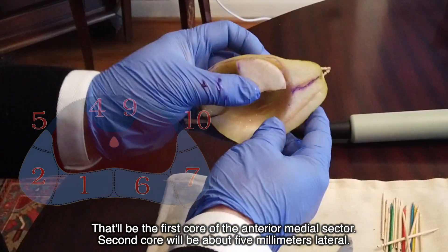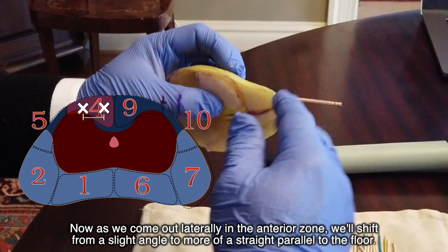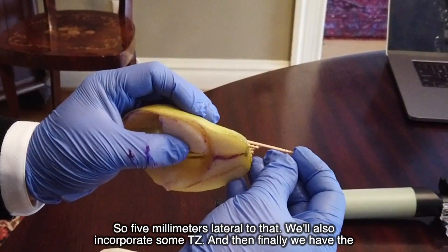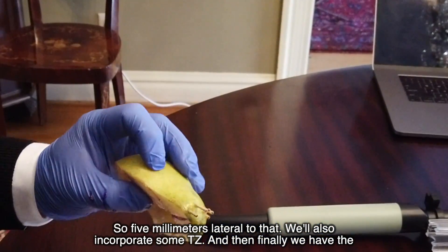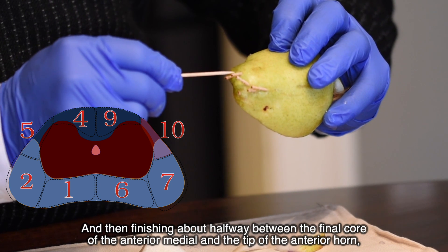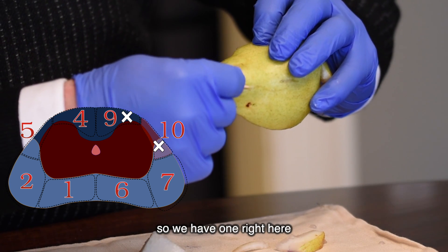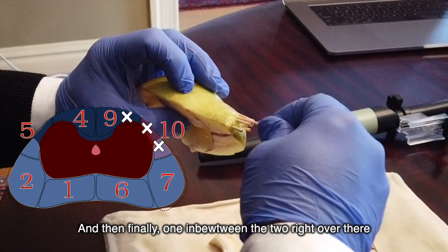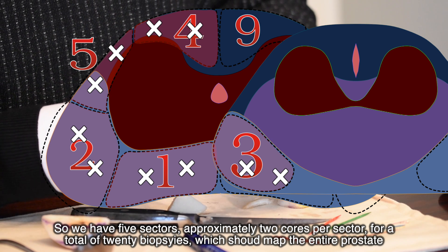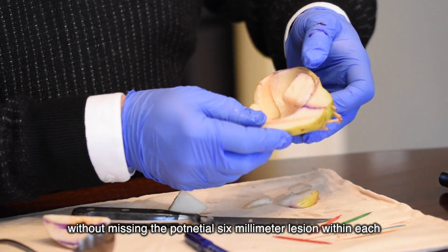The first core of the anterior medial sector is followed by a second core about five millimeters lateral. As we move lateral in the anterior zone, the trajectory shifts from a slight angle to more parallel to the floor. That second core incorporates more TZ tissue. Then we have the anterior lateral sector, continuing up the anterior horn, finishing about halfway between the final anterior medial core and the tip of the anterior horn. That gives us five sectors, approximately two cores per sector, for a total of 10 biopsies — mapping the entire prostate without missing a six-millimeter lesion.